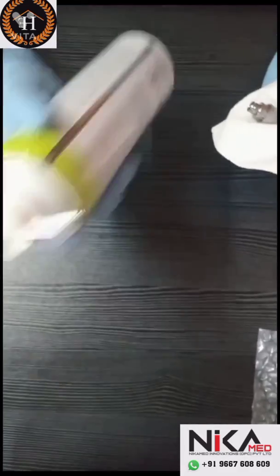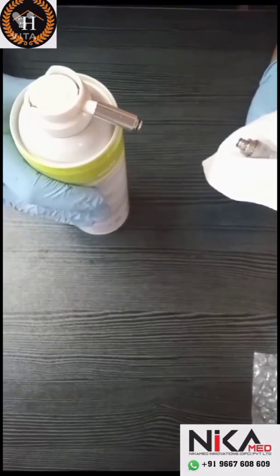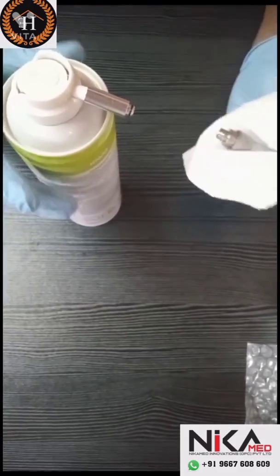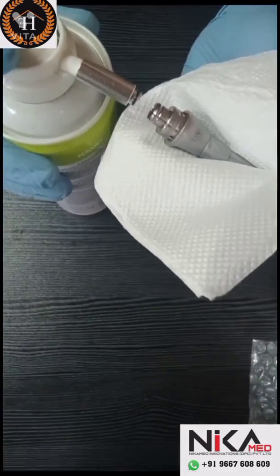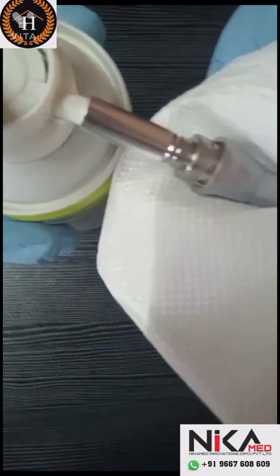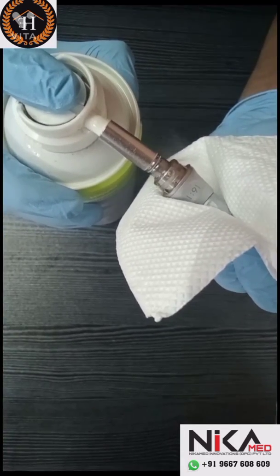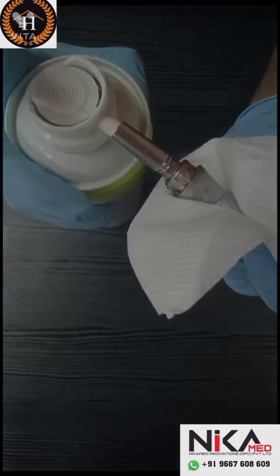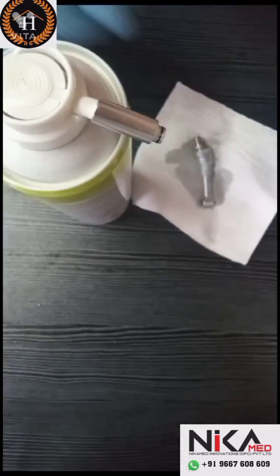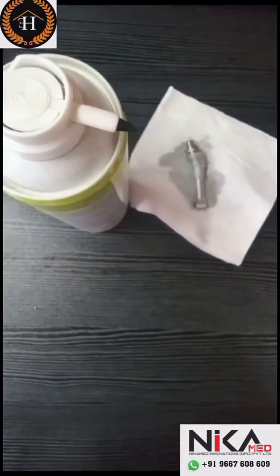Shake the oil bottle and keep it in an upright position. Take a tissue and cover the head of the handpiece. Connect the nozzle to the coupling side of the handpiece — it will properly fit to the O-ring. Now press and hold the button for 2 seconds continuously to get rid of the debris. The head is now completely cleaned and the backside lubrication is done.